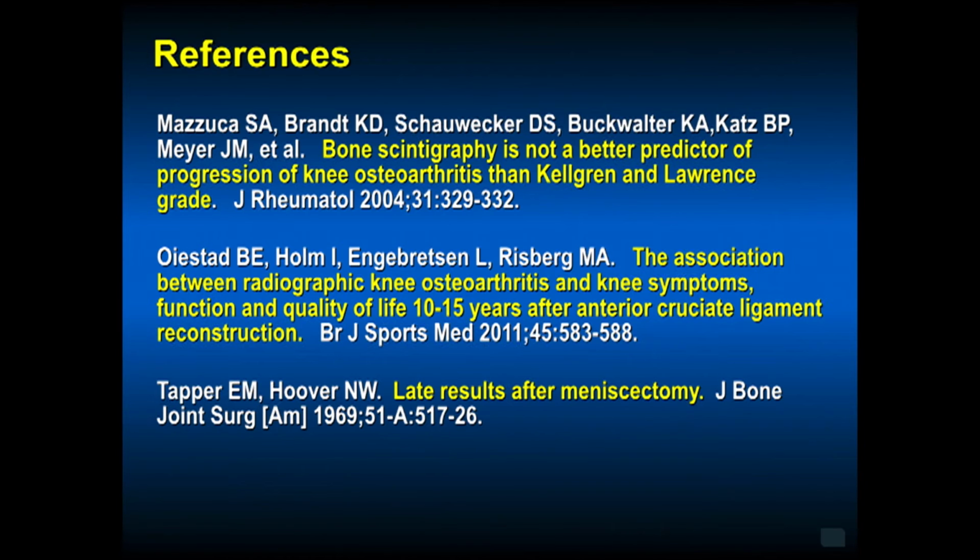These are the references for knee radiographs, views to get, and osteoarthritis.